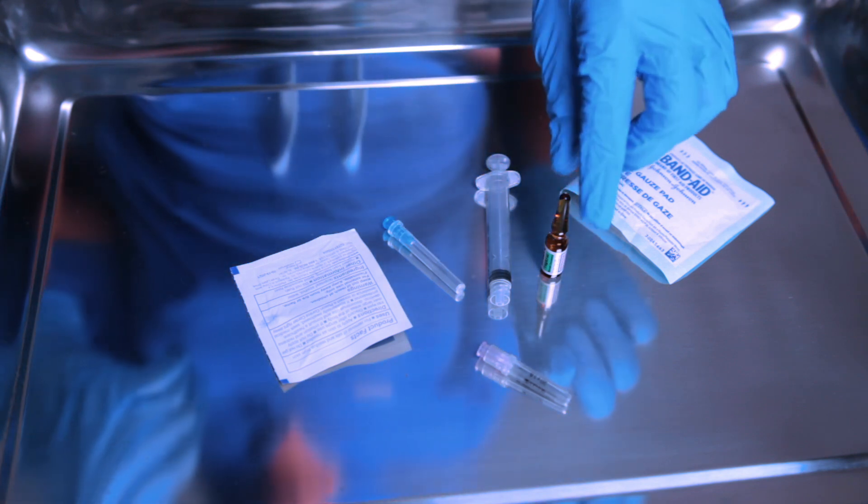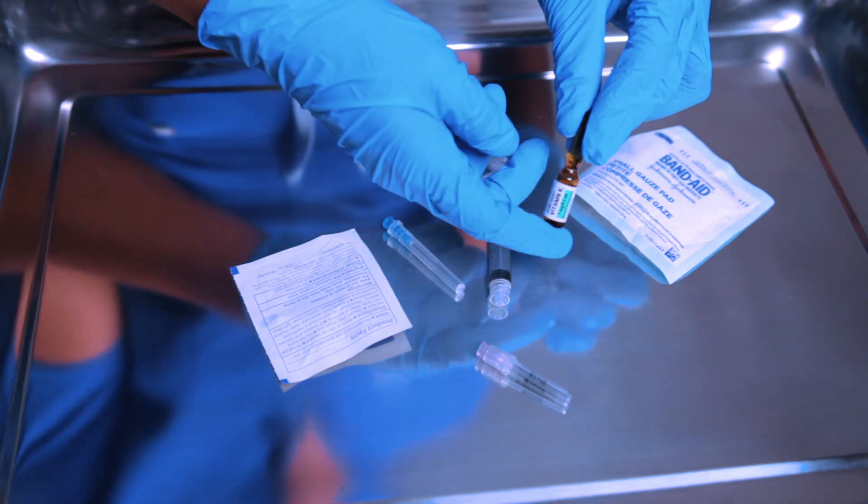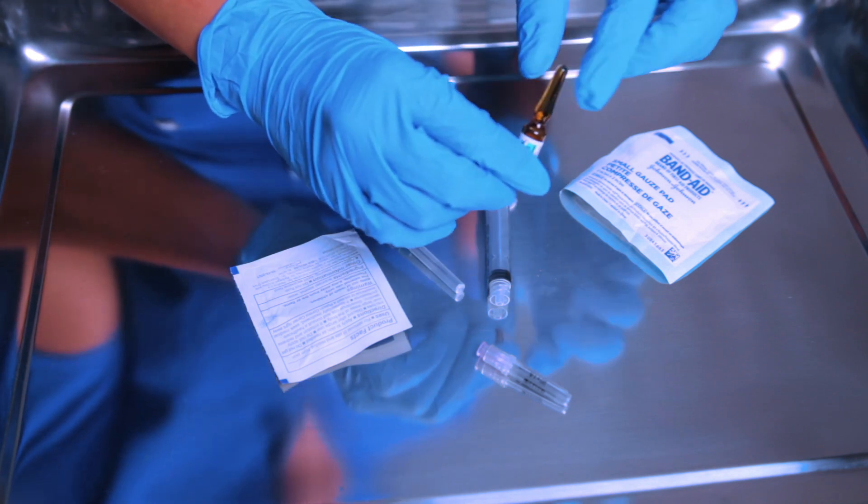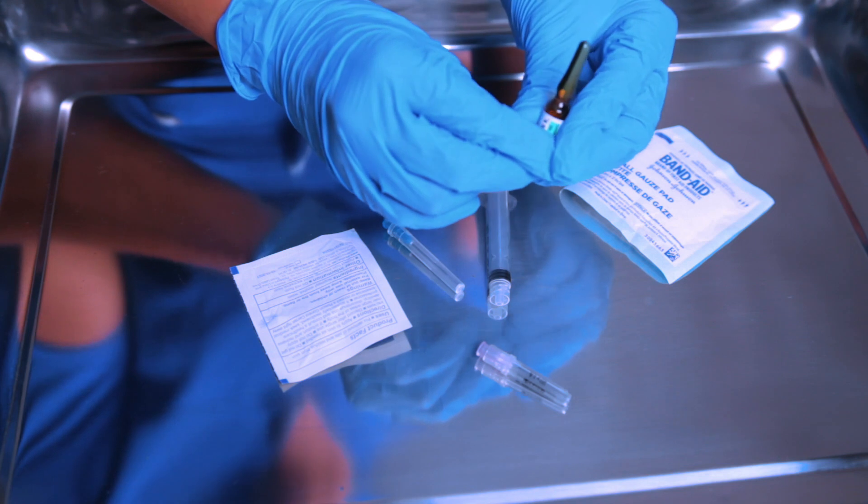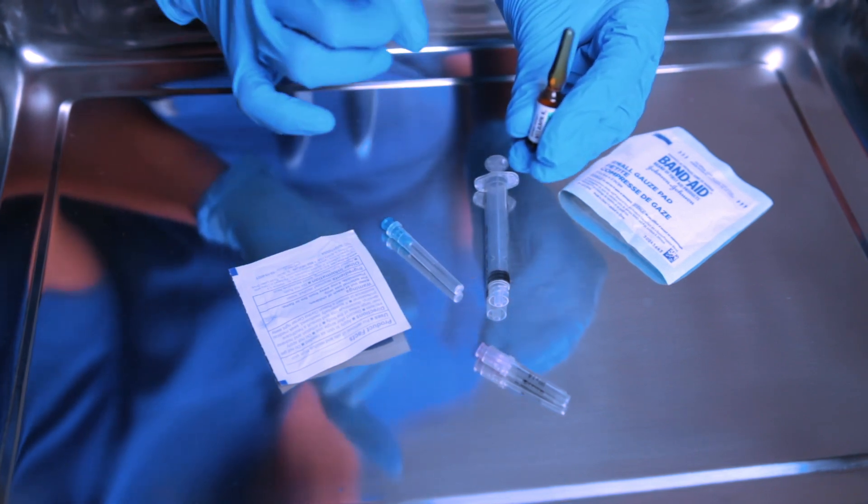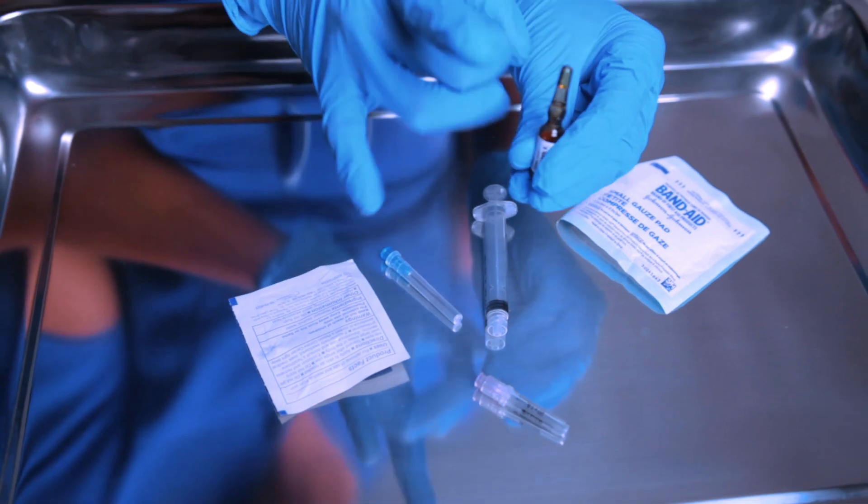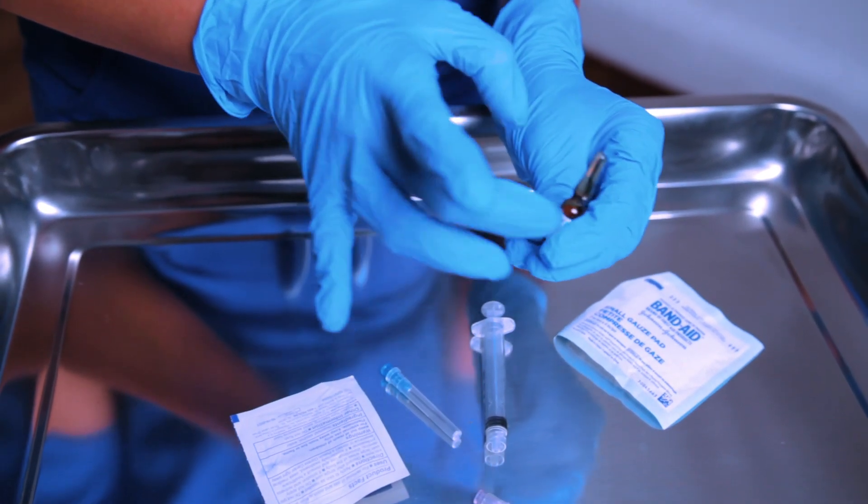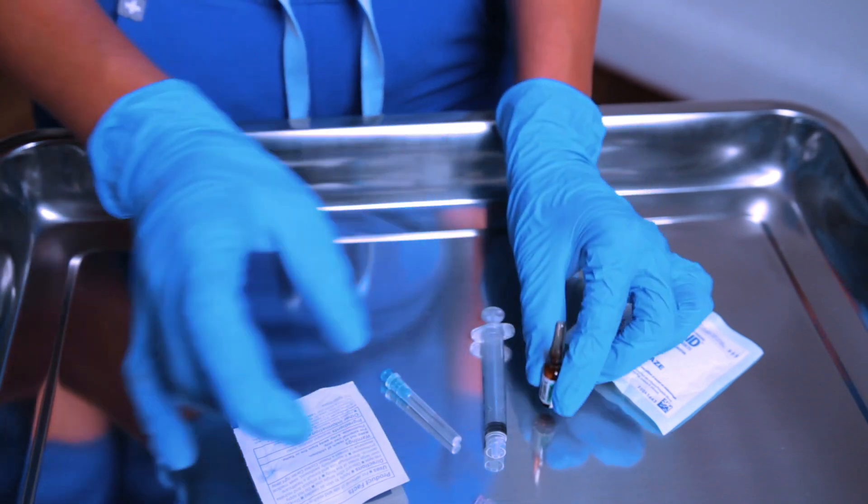Based on the ampule, you have the body, you have the neck, and the top of the ampule. So this is a glass one. So before even cleaning it, you want to flick it because there's volume on the top of here and you don't want it to be wasted. So I'm going to flick and you'll see that it'll kind of pull to the bottom with just a few taps. So you'll have that sitting there.